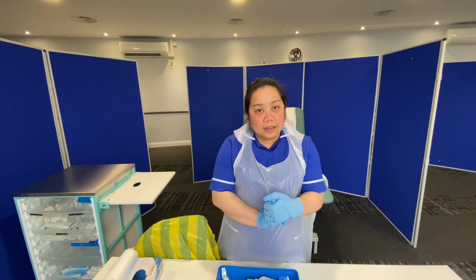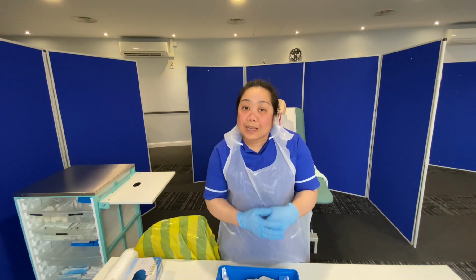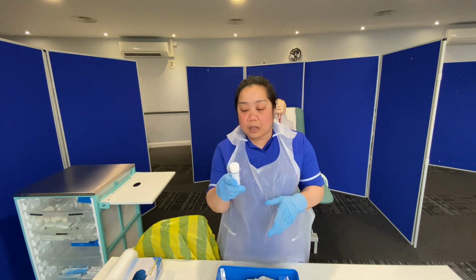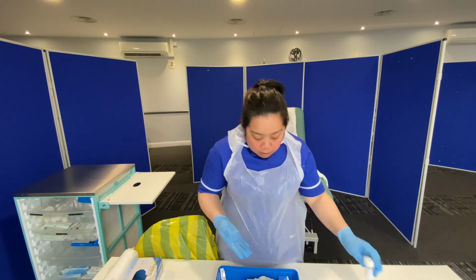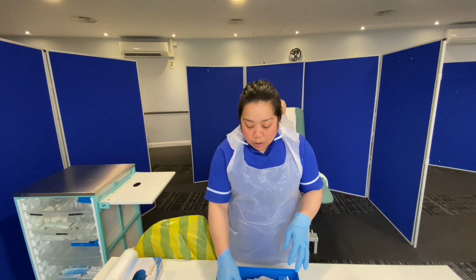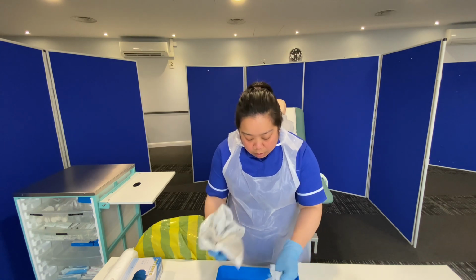So after collecting the catheter specimen of urine at the bedside and after placing it in the specimen container, we must first ensure that it is tightly sealed and properly labeled, and sent right away to the laboratory after it's been obtained. Okay?